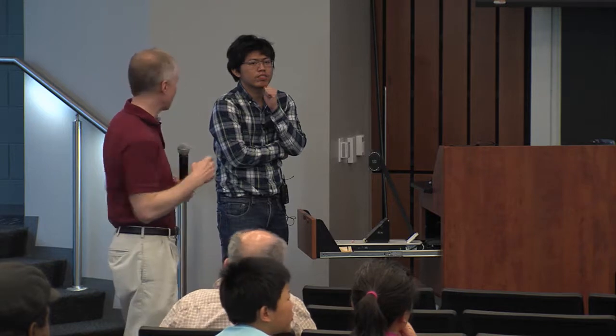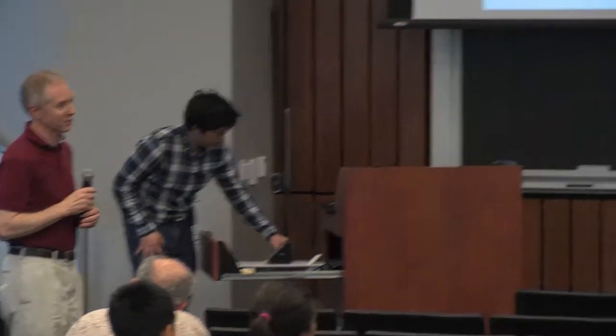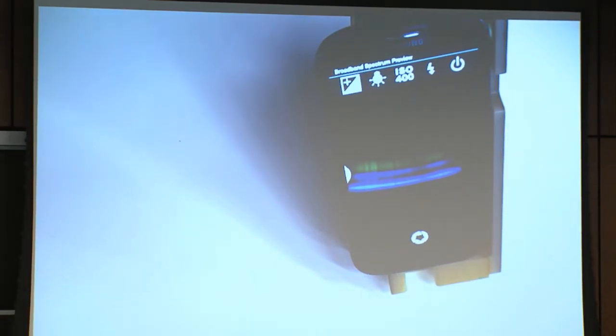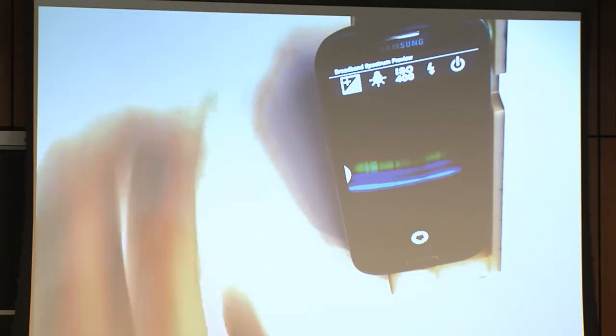In the work we're doing now, we make the cradle by 3D printing it out of plastic. And so we can change the design and print out a new one to adapt to whatever, like the location of the phone's camera or the location of the back-facing LED, or the size and shape of the thing. We can adapt to any phone pretty quickly now.